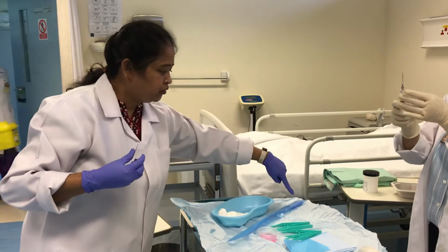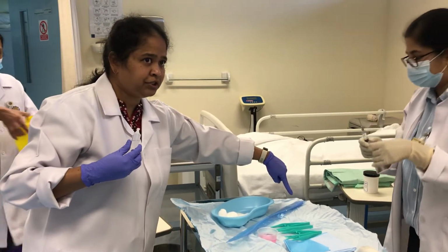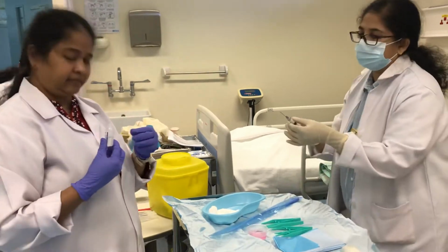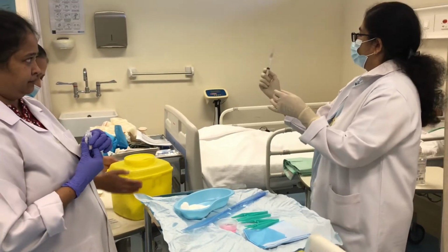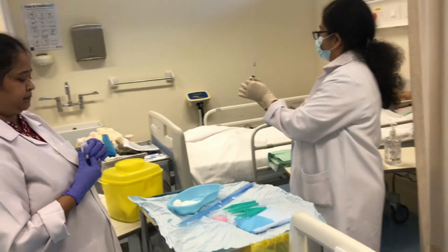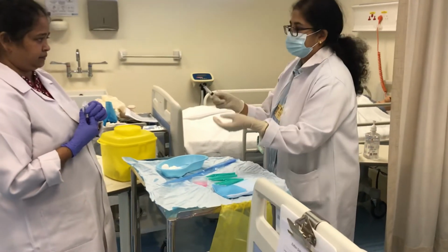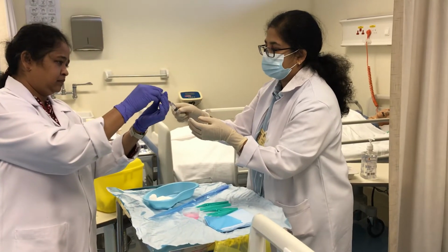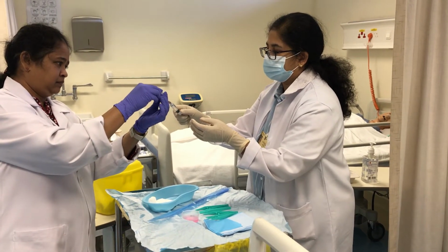Write the amount of water to be pushed for the bulb to be inflated. 5 to 10. I need a little bit more. I'll take 6 and keep it full.